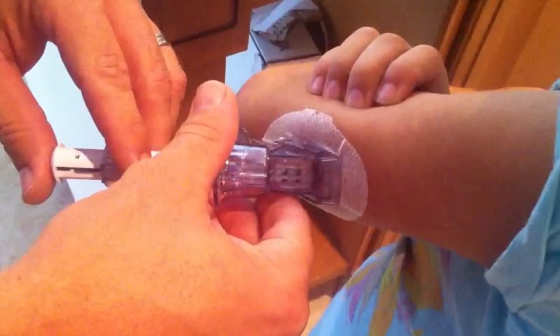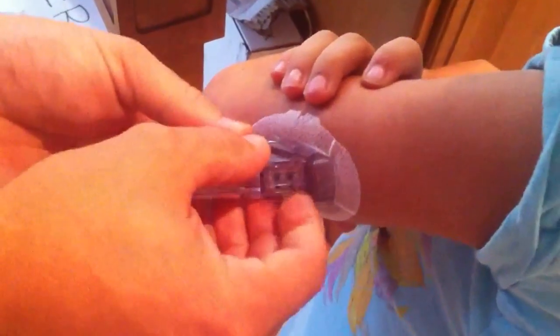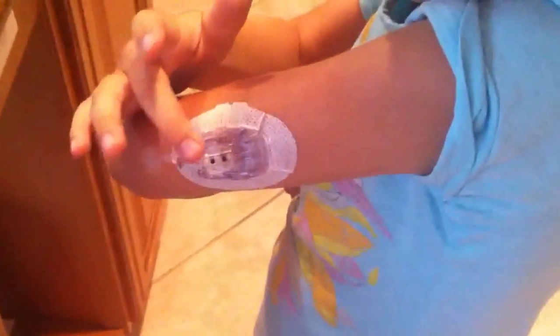So you ready, Ella? One, two, three. Rock star. Big girl! So then how does that work for your showers and everything? It's totally waterproof. Here's the sensor.